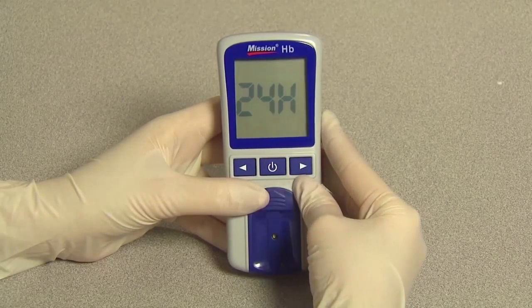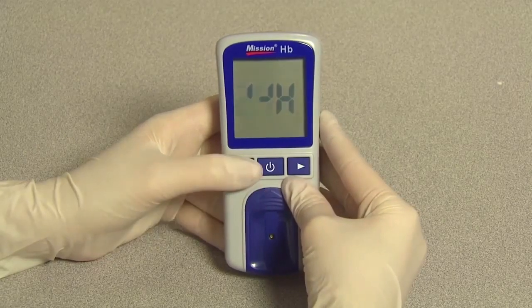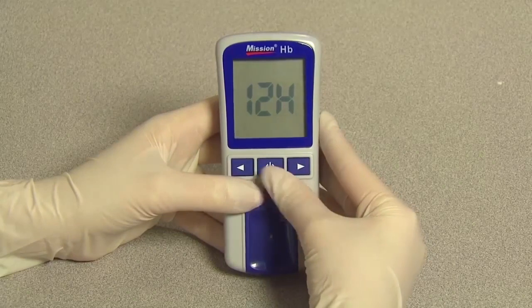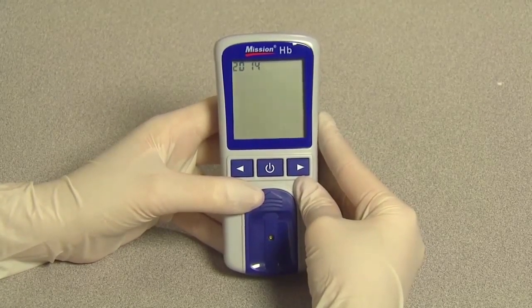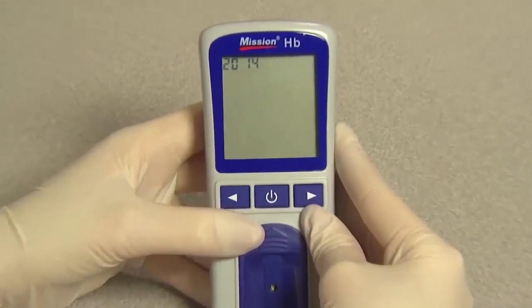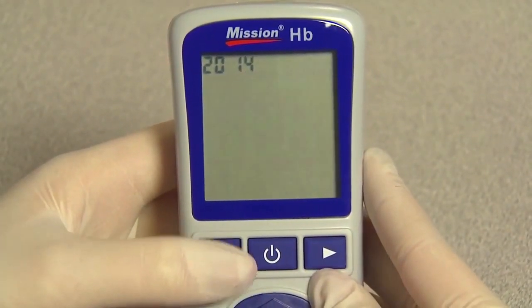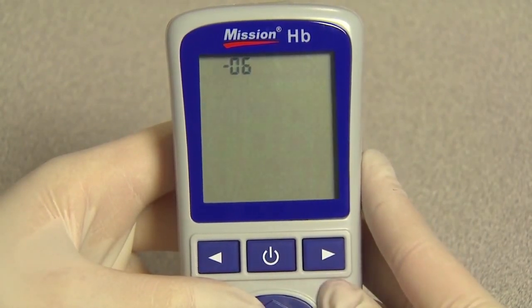The first option sets the clock to either 12 or 24 hour mode. Press right or left to switch between the two settings. Press the power button to save and advance to year setup. The year will appear at the top of the display. Press right or left until the correct year is displayed. Press the power button to save and enter month and date setup.